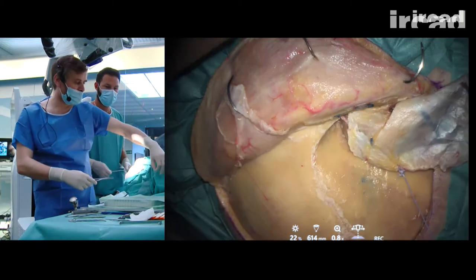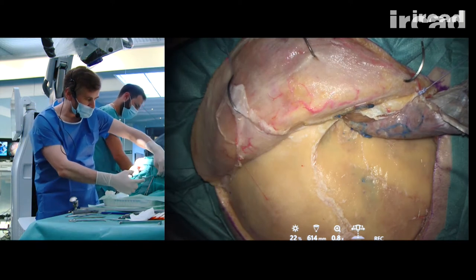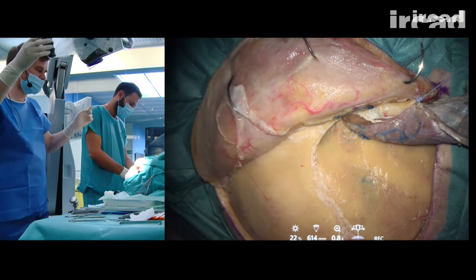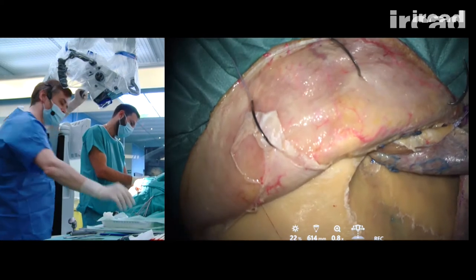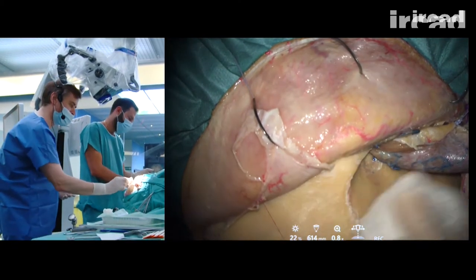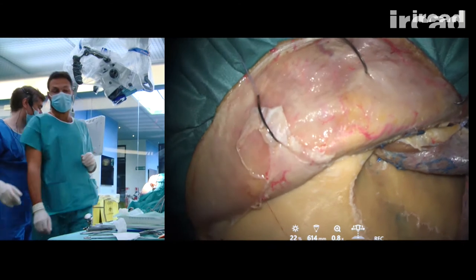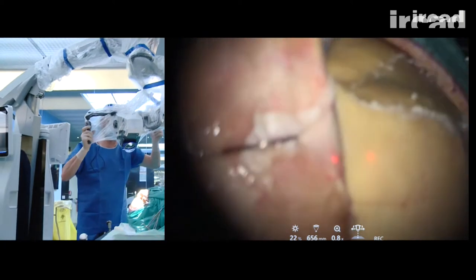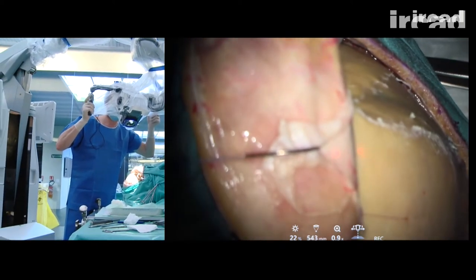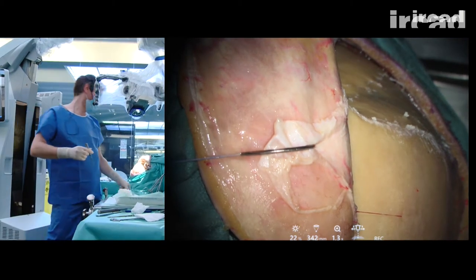So now we are getting ready to start the bony work. The bony work starts with identification of the inferior orbital fissure. And for this, I need to get into the orbit and to elevate the periorbita from the superior orbital wall and the lateral wall of the orbit. So to elevate the periorbita, I change my position in order to really face the patient and to see the tip of my dissector into the orbit.